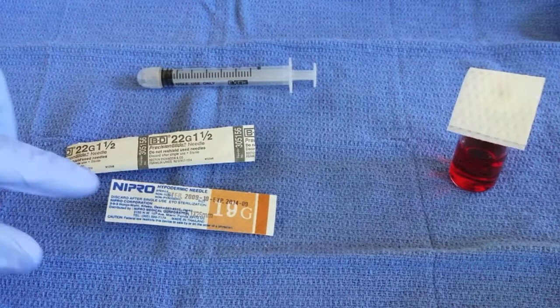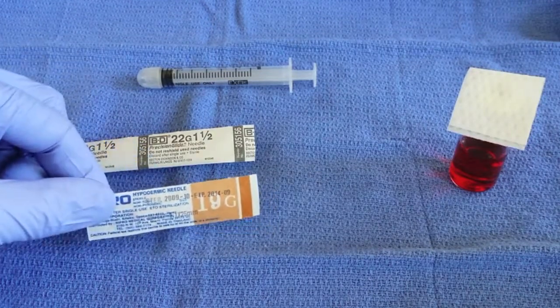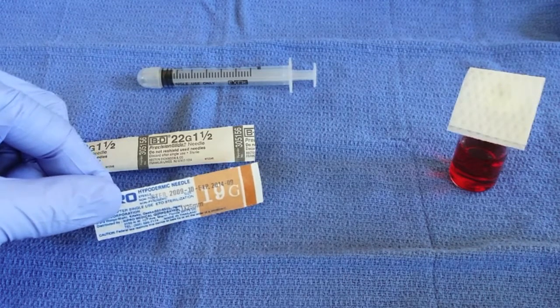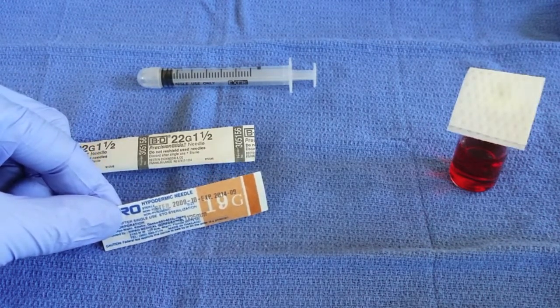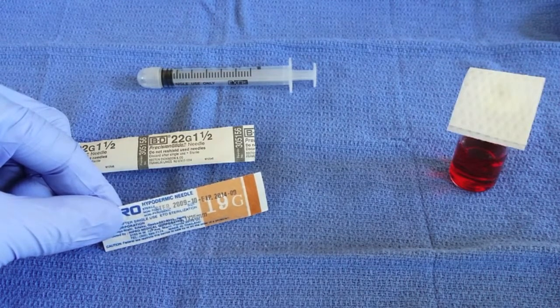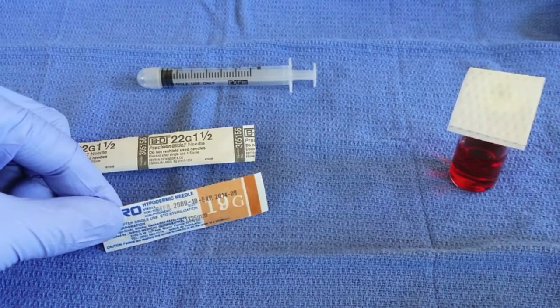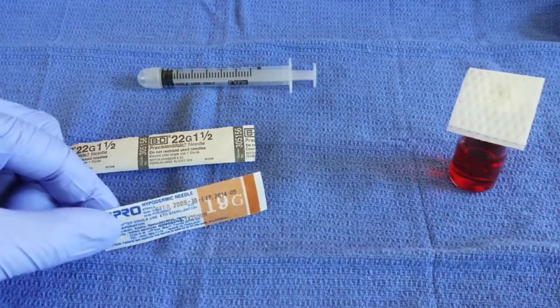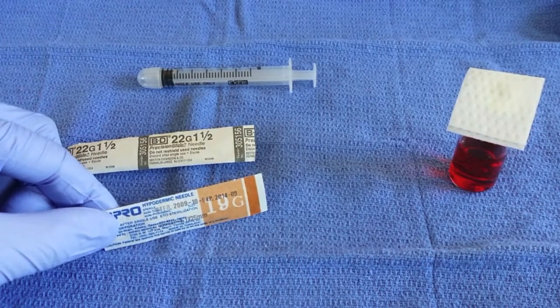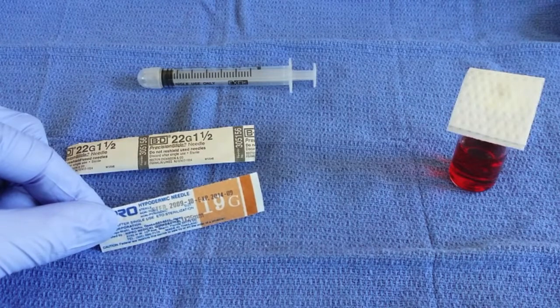Next, we're going to use our 19 gauge needle in order to withdraw our B12 from the vial. This is particularly helpful when you're using a thicker solution such as a testosterone cypionate solution. In this case, it's not necessarily required for the B12; however, we'll use the 19 gauge needle in order to demonstrate switching needles as well.